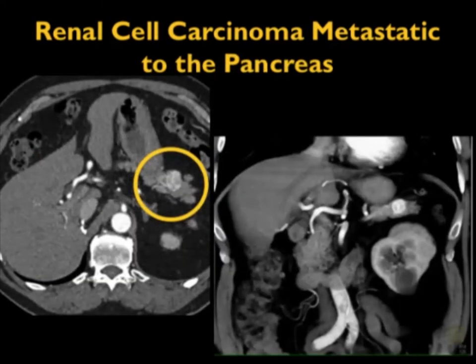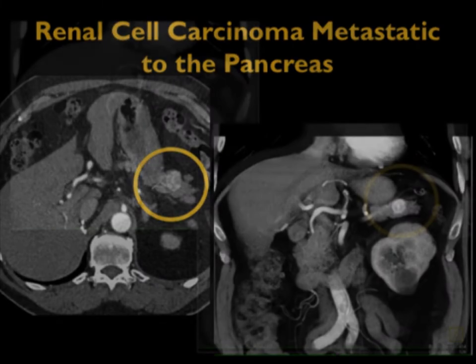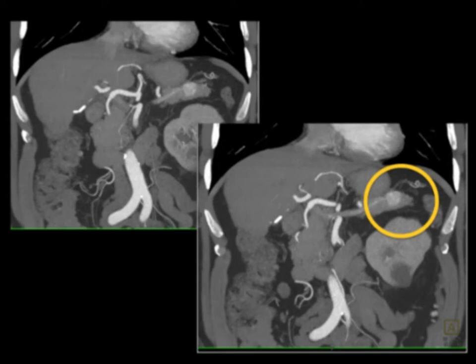Here's an example. Look at the tail of the pancreas. This patient has a right nephrectomy. You see the surgical clips. There's the lesion in the tail of the pancreas. Now, anybody else, I would say there's an obvious neuroendocrine tumor, but you show me a vascular lesion, looks neuroendocrine, and you show me an absent kidney, I'm telling you metastatic renal cell carcinoma. And just a beautiful example. And so if you're looking for Mets, there they are.